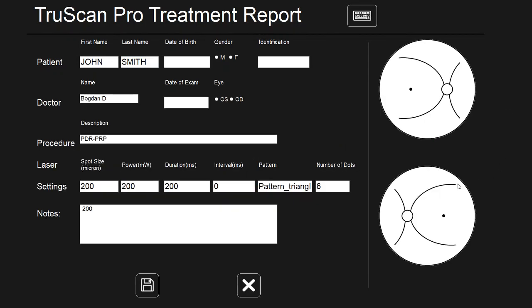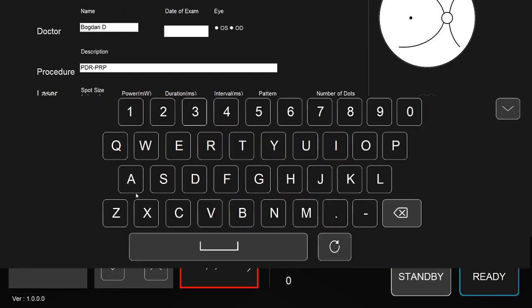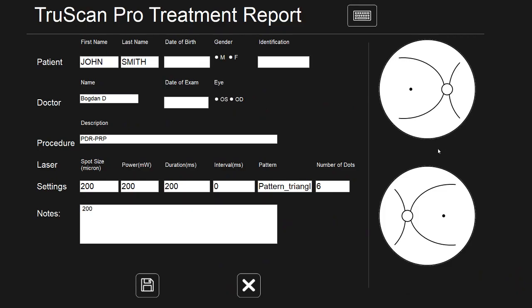You can enter in the patient data. As you can see, all of the settings used during the treatment are listed here. You can make notes, and once you are finished, click save.